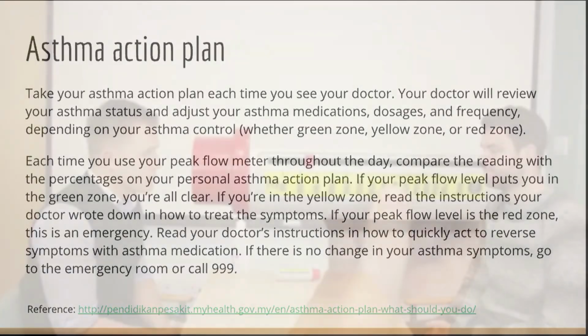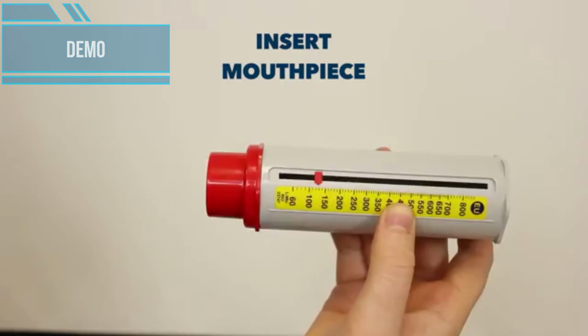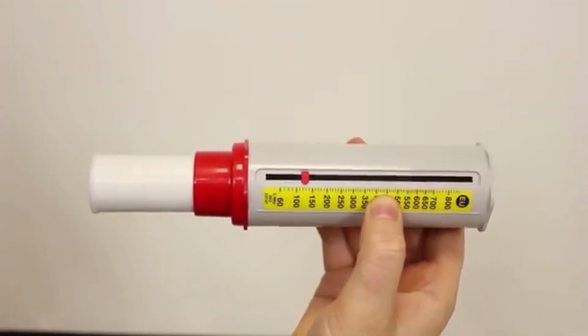Okay, Simon, in terms of setting up the equipment, the important aspects are to ensure that the mouthpiece is inserted into the peak flow meter and to ensure that the dial is set to 0.